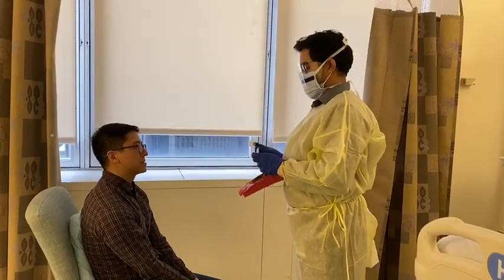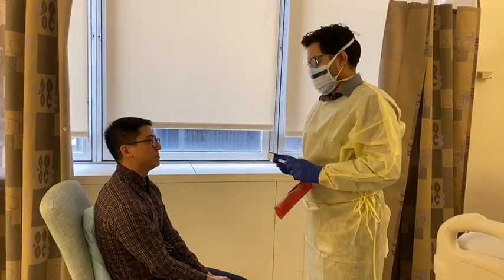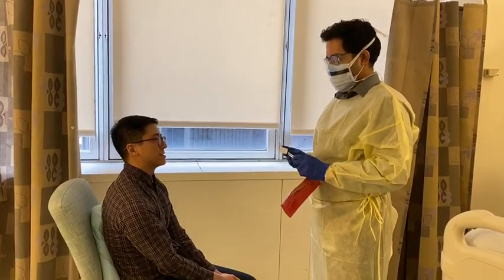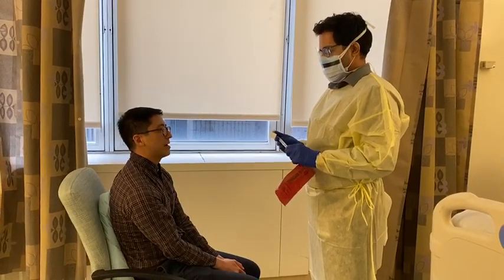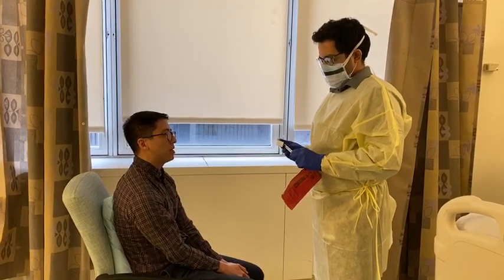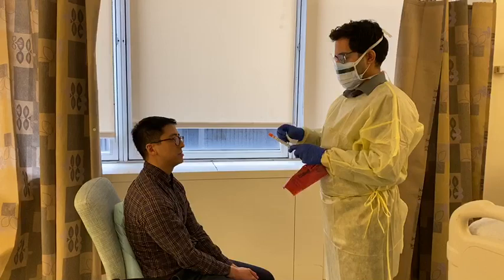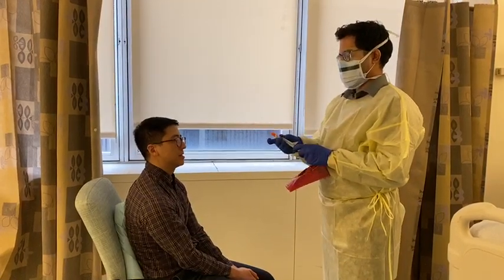We're going to demonstrate how to do a nasopharyngeal collection, a swab, for COVID testing. Dr. Narayan has the appropriate swab. The first thing he's going to do is put the label onto the testing kit, the tube.